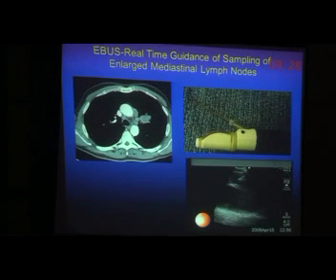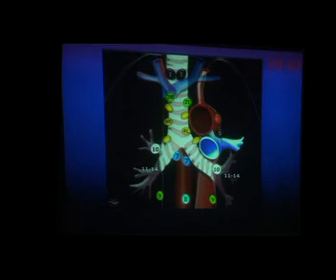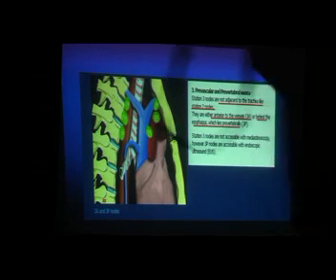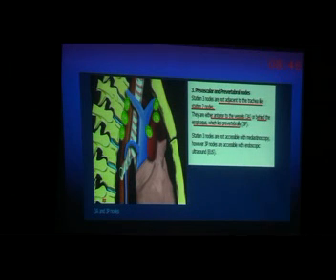Endobronchial ultrasound will be covered by the next speaker, Professor Semra, during her talk. That's the real-time one. Actually, we don't have it in our department. We have the radial one. If you're going to perform EBUS, you have to know the anatomy very well. You have to know the stations, the different paratracheal, subcarinal, etc. And it's important, some of the lymph nodes are not accessible by the EBUS, like the 3P and the 3A, even by mediastinoscopy. So it's challenging, and it's a very fruitful tool in our armamentarium in diagnostics.